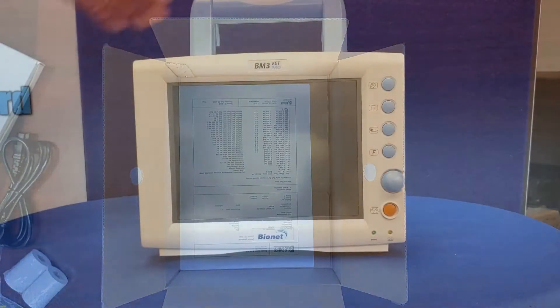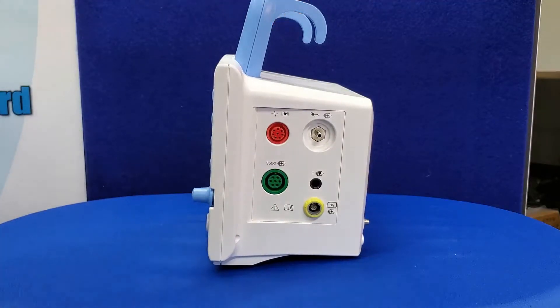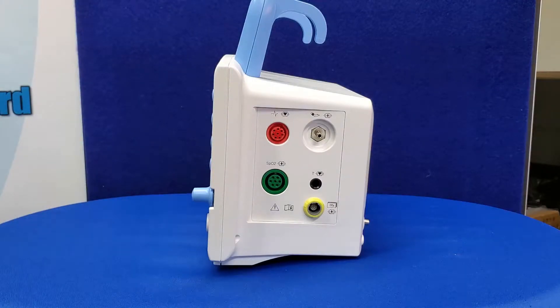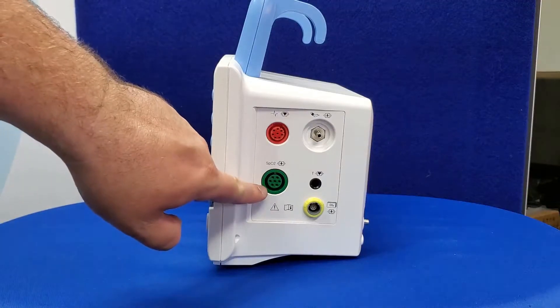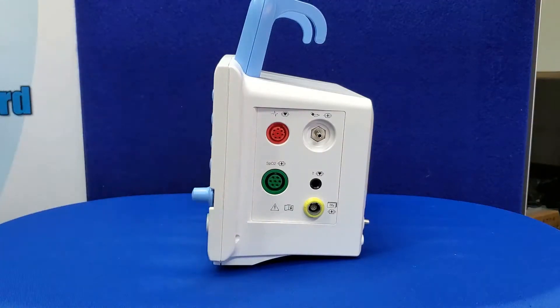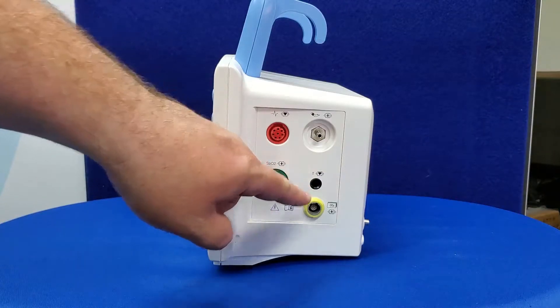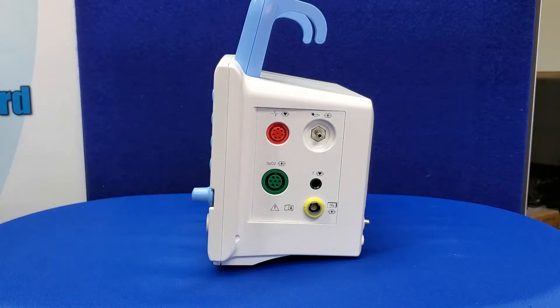Let's move on to looking at your monitor. On the side of the monitor, you will note the various ports for your sensors and probes. The red port is for your ECG cables and is round on the BM3 Vet Pro and rectangular on the BM5 and BM7 Vet Pro. The silver hose connector is for your blood pressure tube and the green port is for your SpO2 sensors. The jack port is for your temperature sensor. This port is used in conjunction with your ECG port when using the esophageal probe, as the probe will connect here along with your ECG extension cable.